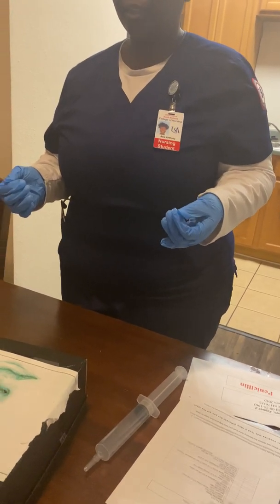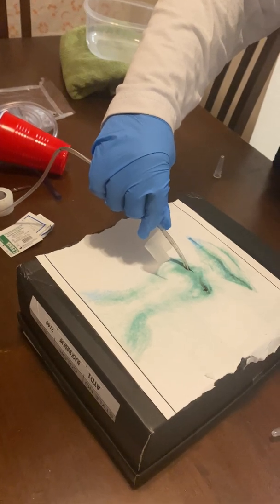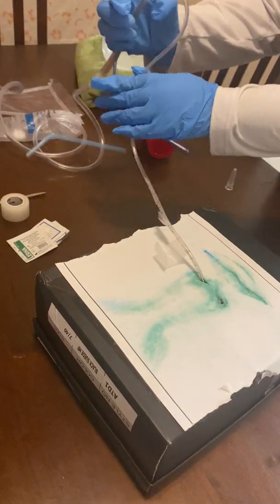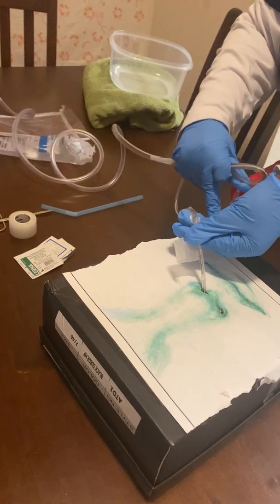I would ask the patient to get ready to breathe in and hold while I get ready to remove the tube. And I'm also going to make sure that it is kinked before I remove the tube. So here, and I'm just going to slowly come out.